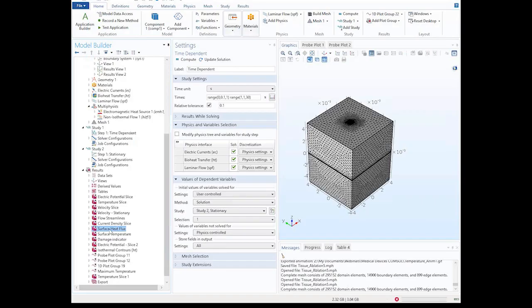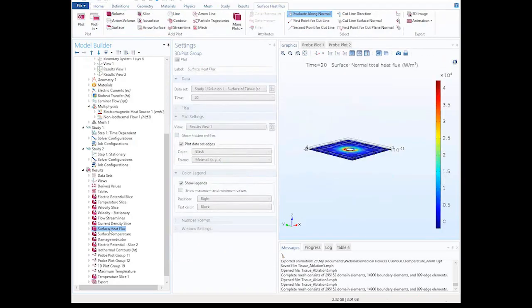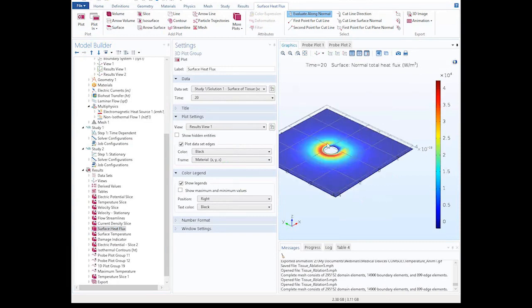One you didn't see, which I think is important, is this. This is the heat source, the heat flux normal to the surface of the tissue. So this is the surface of the tissue. Tissue is below, blood is above, and you see it's non-symmetric. So really, you need a CFD analysis to get that. Basically, there's more efficient heat transfer at the upstream end of the flow rather than the downstream. You can only capture that if you actually have the CFD.